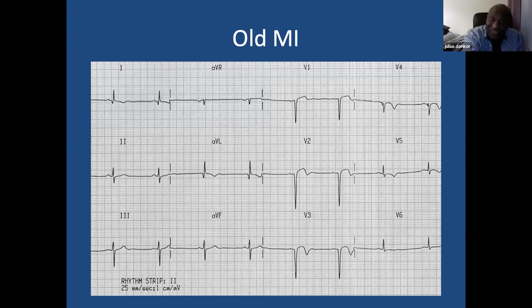There are no reciprocal changes there, so you're looking at a massive Q wave. If you were calling this a recent MI, then there should be some kind of reciprocal changes in the inferior leads, but there's nothing at all. And you've got really deep Q waves like that, with slight ST elevation. That's definitely an old MI, yeah.